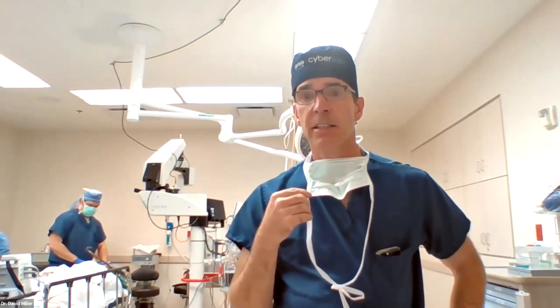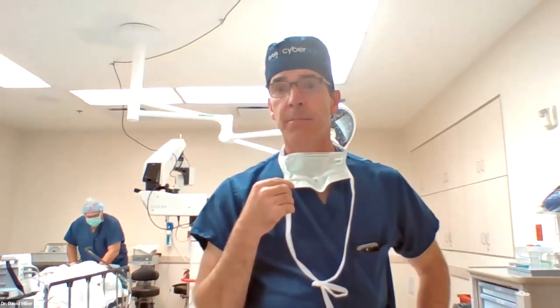And now the last question here is, what will be the preferred to this procedure, laser, please? I'm not exactly sure what you mean, but if we had the laser, it's looking around for retinal tears under scleral depression and making sure we don't have a problem.